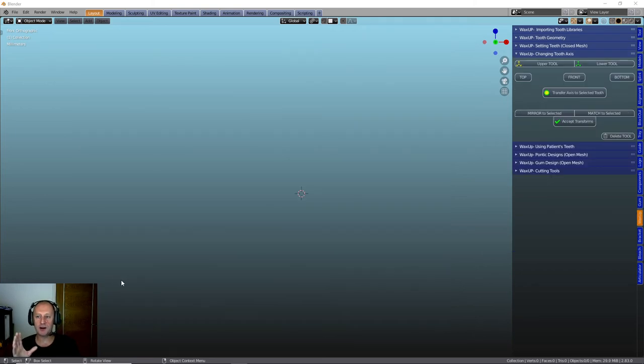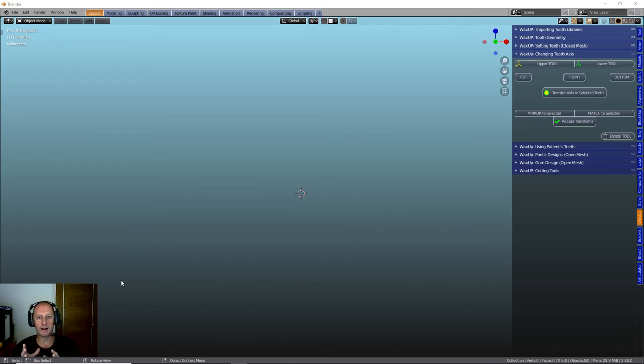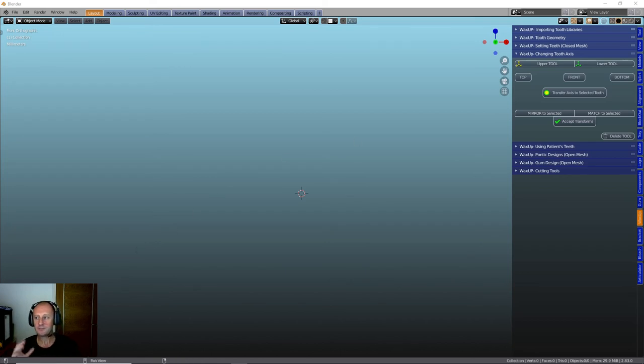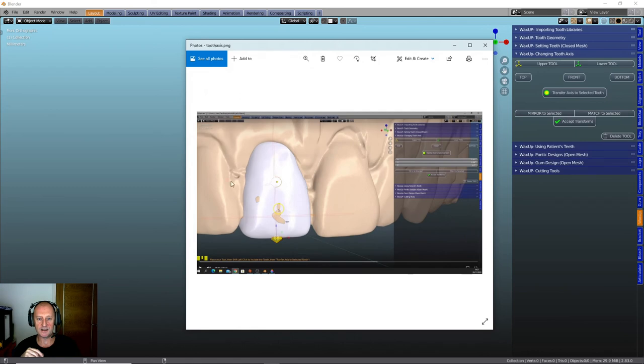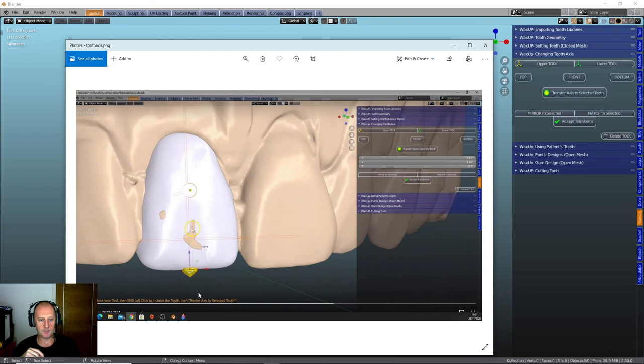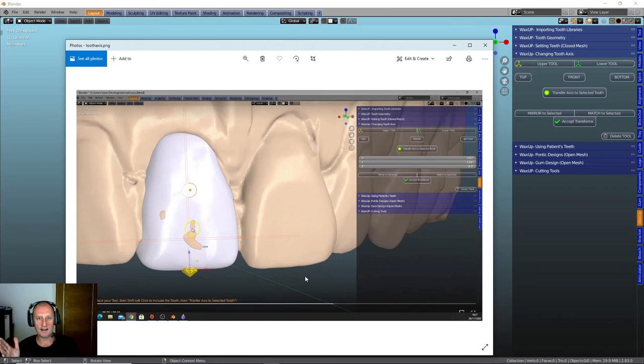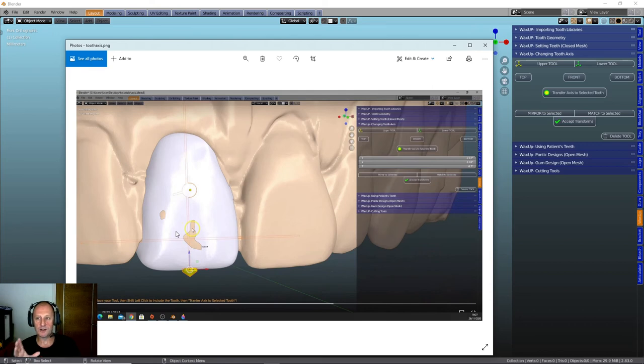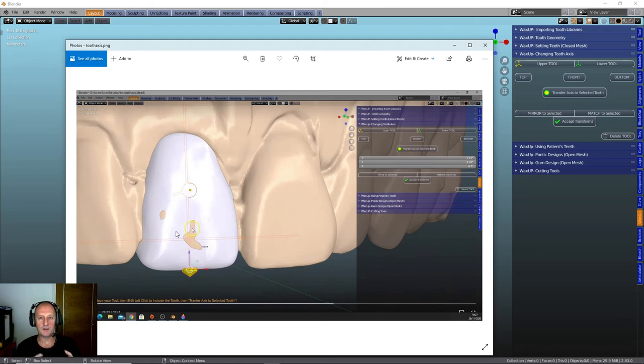Then we've got this, one of these options is the changing of the tooth axis. This is a clever little way of working where if you've got, and you're trying to match up some teeth to the patient's original dentition, if you're replacing the lateral and the central and you want it to match the axis, there's a nice little tool. And they use this sort of, I don't know what you call it, a widget or something, this bar where you match it up to the existing dentition and then you can replicate the angle and orientation of the tooth you're putting in. It looks, it seems to work very well. I haven't played around with it too much. I've watched a few videos on it and I can see it's a very clever and once you're used to it, a very simple way of getting the angulation correct to the teeth that you're trying to copy.